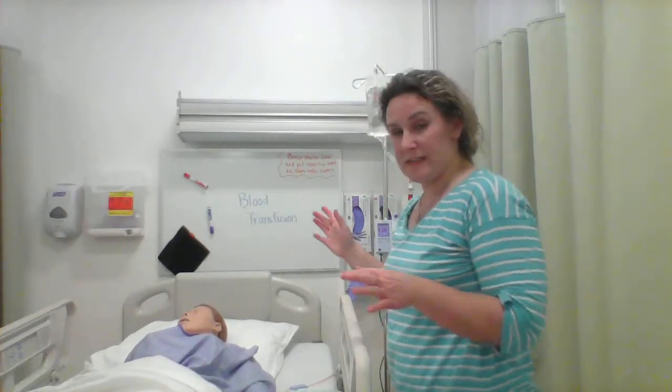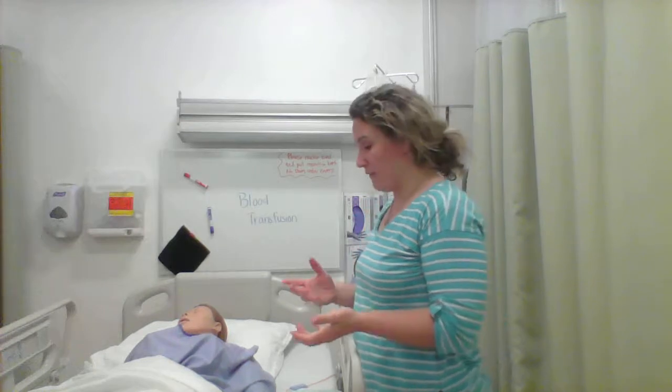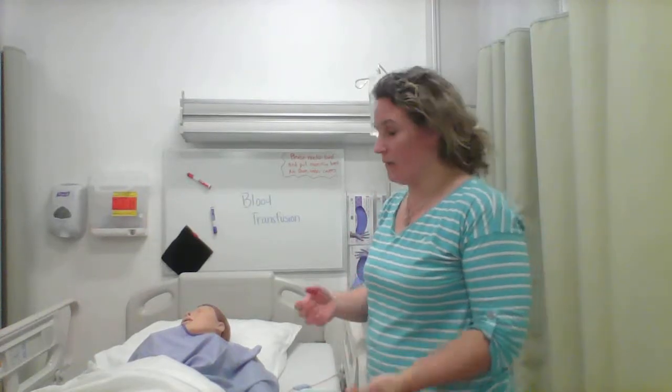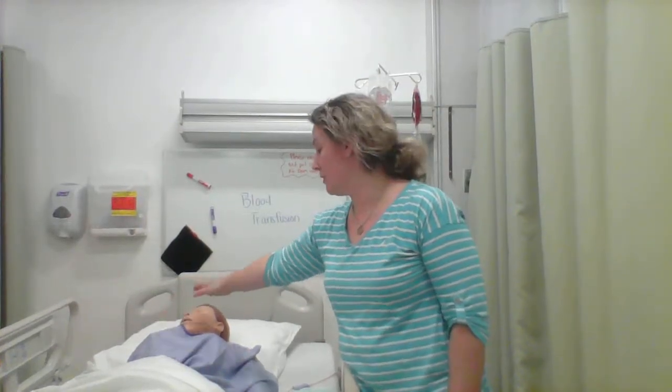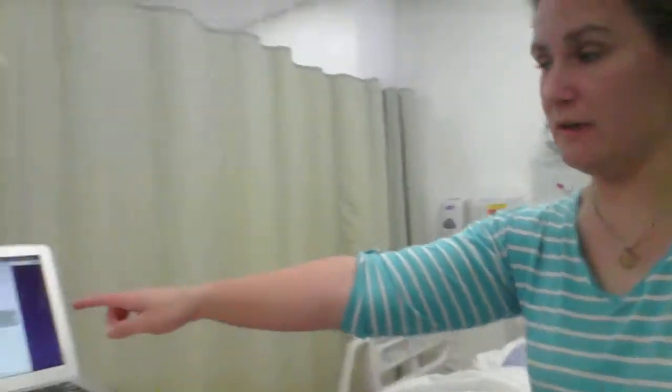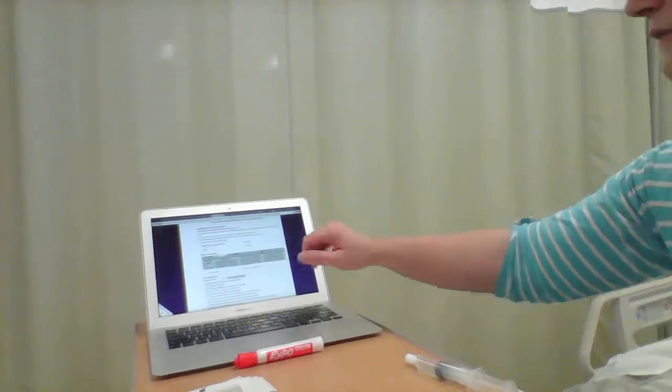So we're going to go ahead and stay with the patient for 5 minutes. At 5 minutes, I would do a blood pressure, a temperature, and a pulse. And then at 15 minutes, I would do that again, a blood pressure, a temperature, and a pulse. And at 15 minutes, I would come back to the EHR and document that rate right here, 15 minutes.